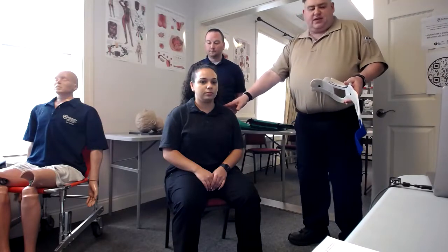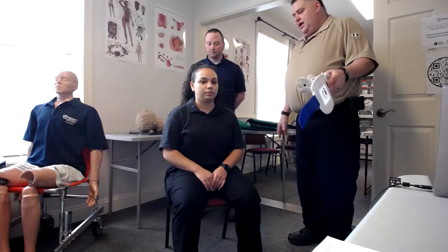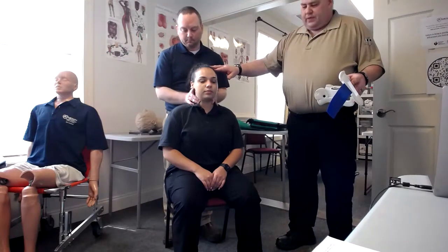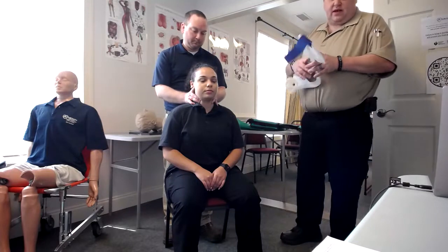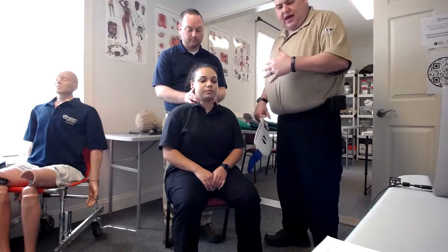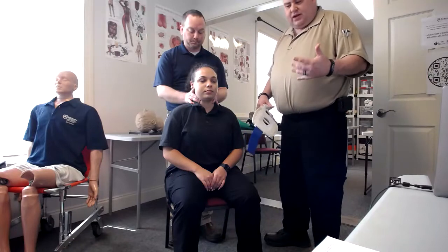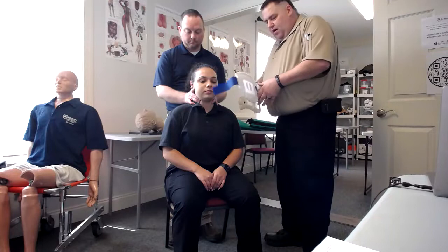We have our victim sitting in the car here — we're going to pretend there's a car around her. So we get on scene, we're going to have our partner get in behind her and take manual C-spine control. This is to keep the patient from potentially injuring themselves. While they're doing that, we're going to come in and ask them: are they having any numbness, tingling, or other joint or muscle movement problems that could indicate potential injuries when we do this?